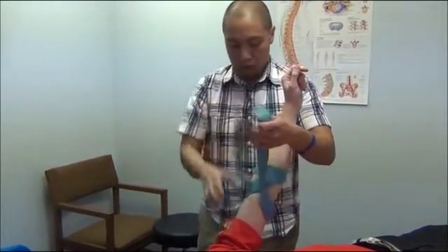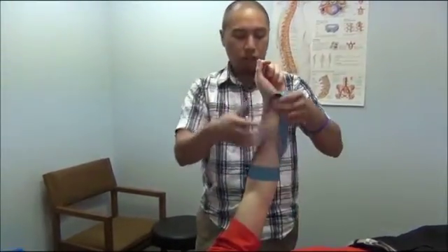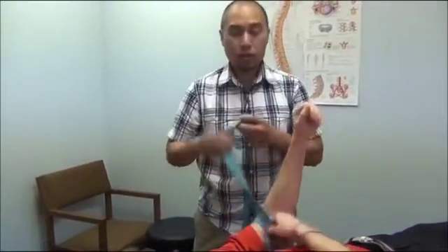A lot of times, if you have very, very uncomfortable paresthesia, this actually reduces that or almost eliminates it in some cases. Thus, the movement itself, the neurodynamic movement itself, is much more comfortable. And the closer they get to end range, the more likely you are to have lasting improvements in range of motion.